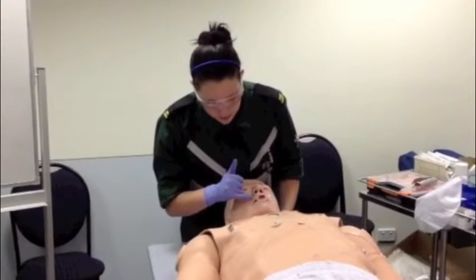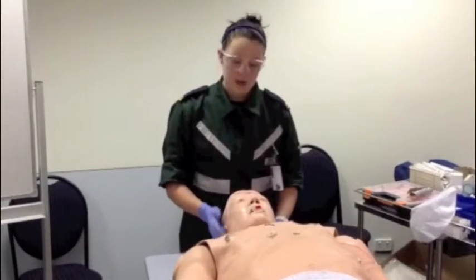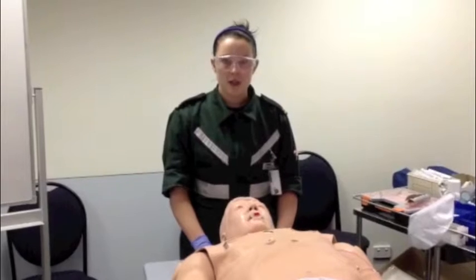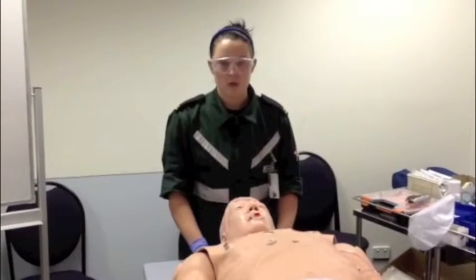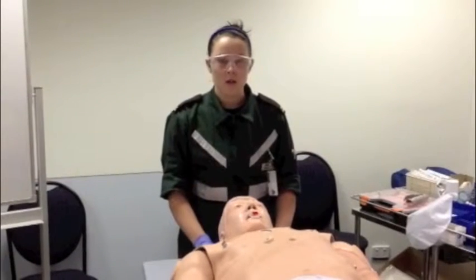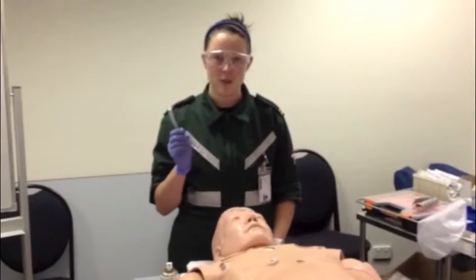You have to ensure that the tongue does not get caught between the teeth and the OPA. Once it's in, you must check for breathing or a gag reflex. One common error of this is inserting an OPA which is too small. This will not adequately depress the tongue, or if you insert an OPA that's too large, it may cause an obstruction.